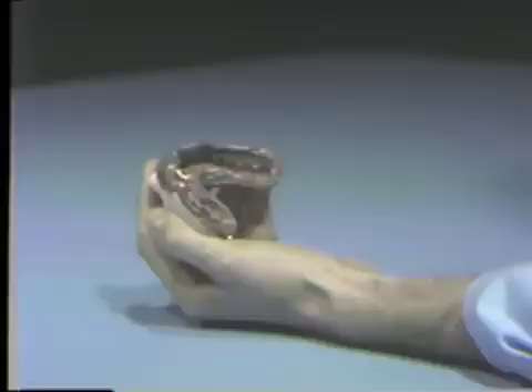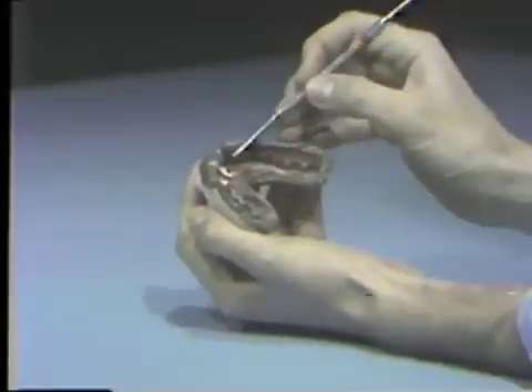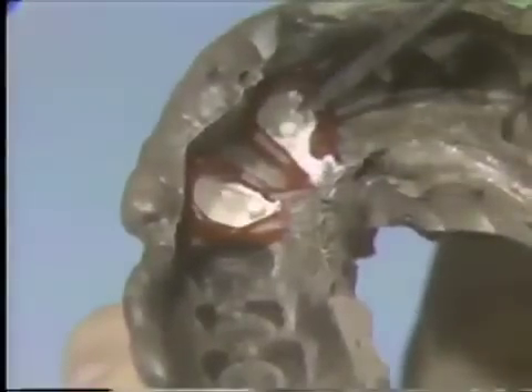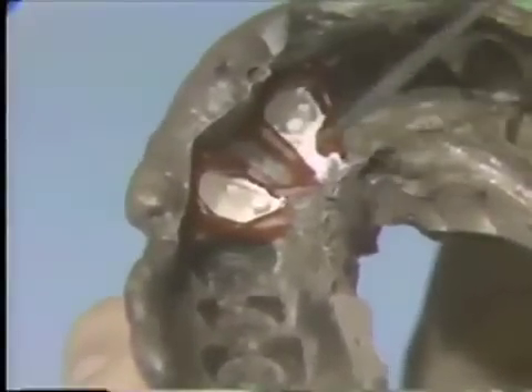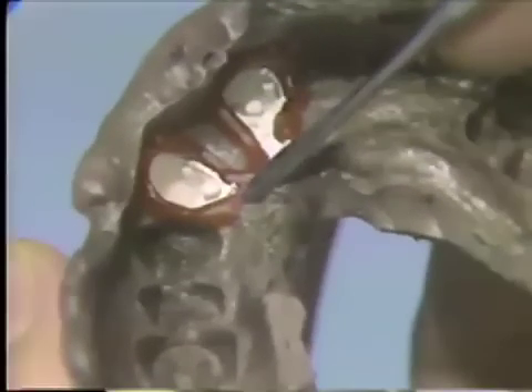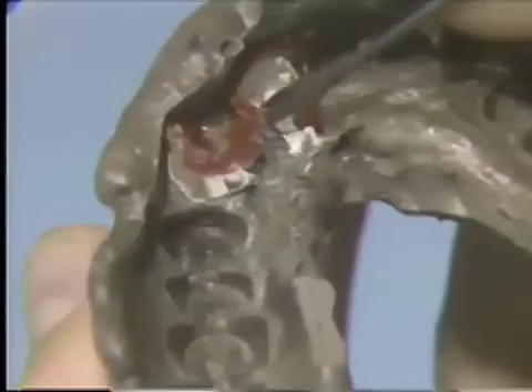When the silver-plated impression is returned from the laboratory, carefully check that each preparation has been adequately silver-plated. The residual red utility wax may now be removed. This is carefully teased away with the number 7 wax spatula.